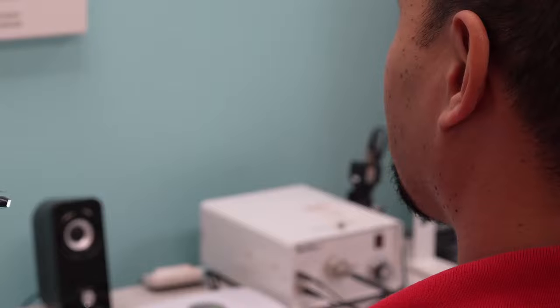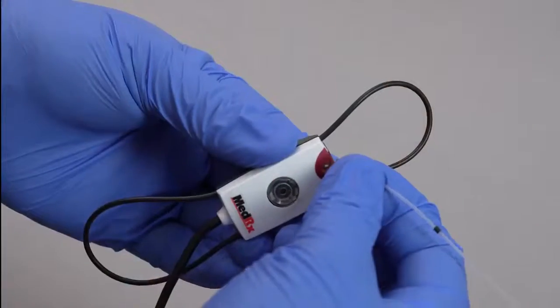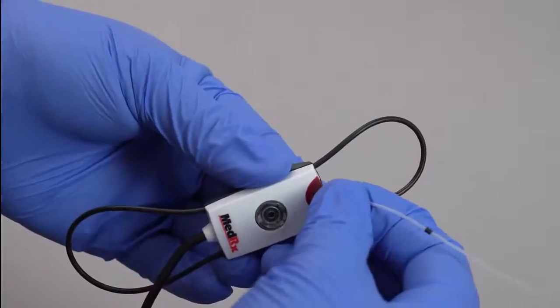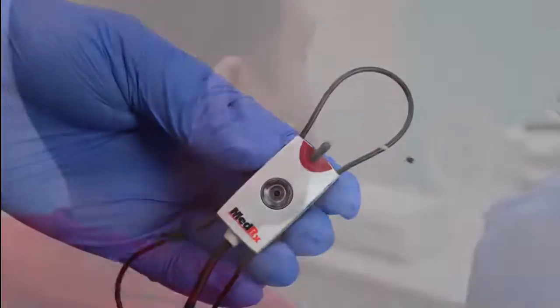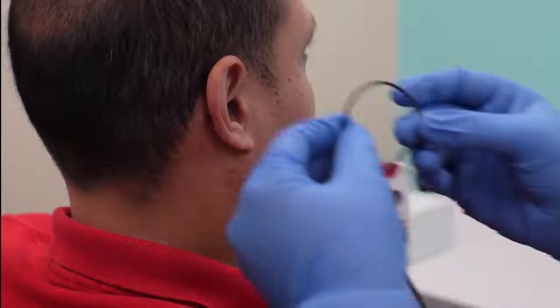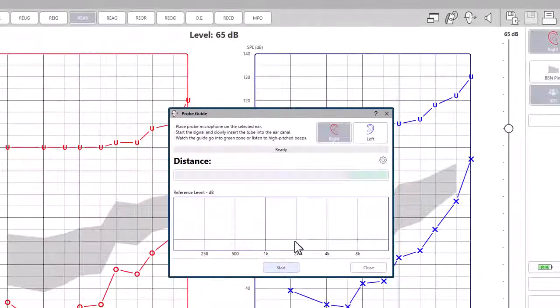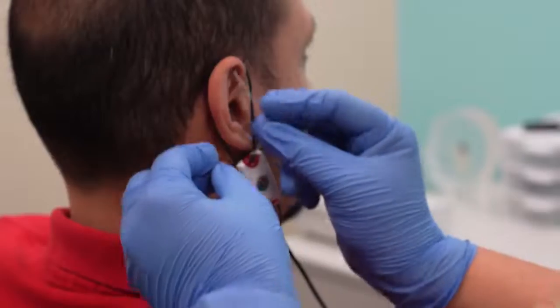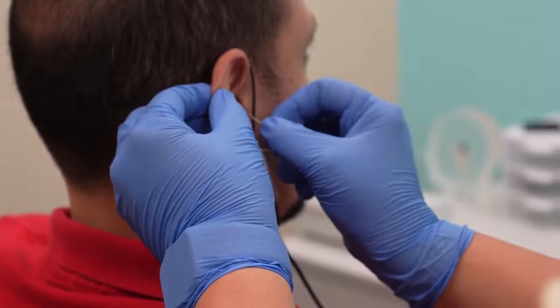Position the client in front of the loudspeaker at a distance of no more than one meter. Attach the probe tubes and hang the REM probes on the patient's ears. Click start and begin by placing the probe tube in the selected ear.